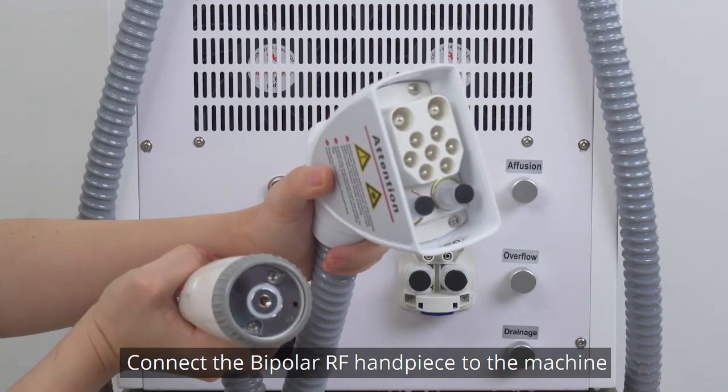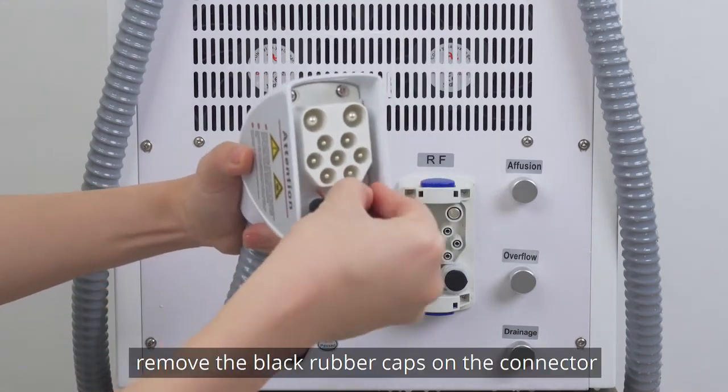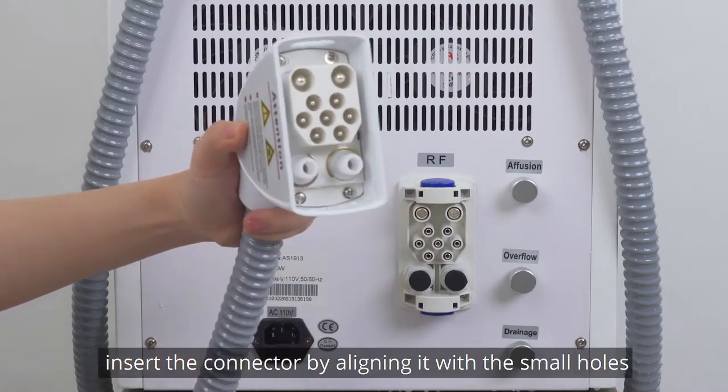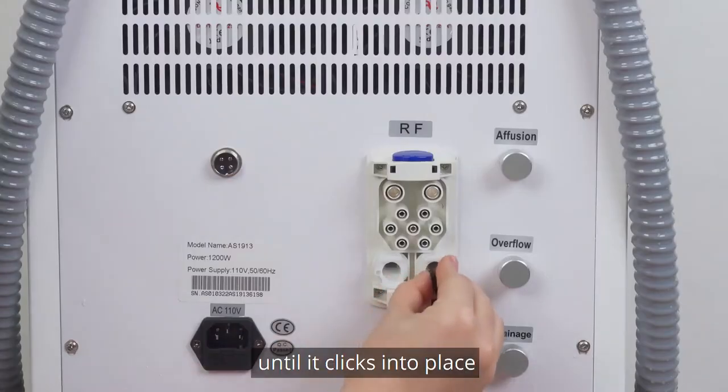Connect the bipolar RF handpiece to the machine. Remove the black rubber caps on the connector and add the connection. Insert the connector aligned with the small holes and add the connection until it clicks into place.